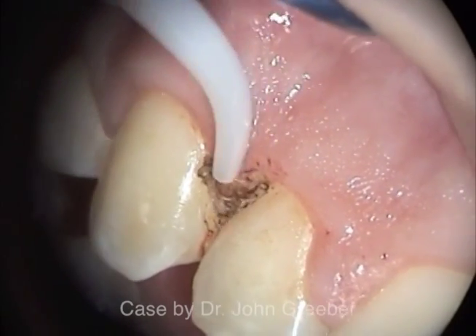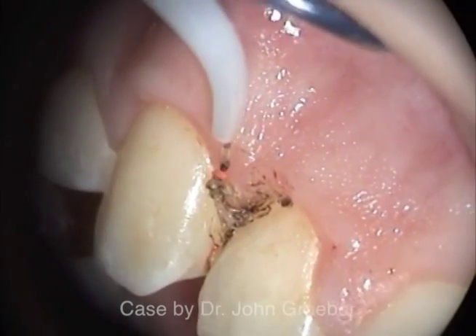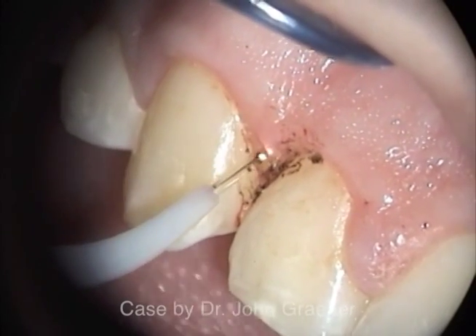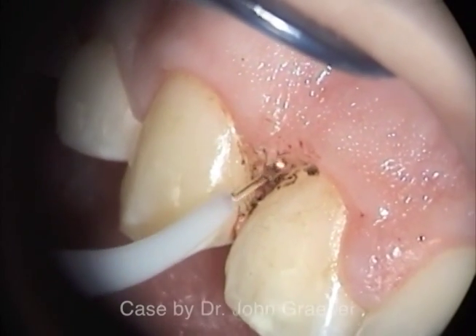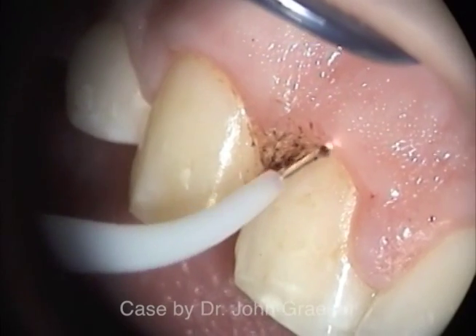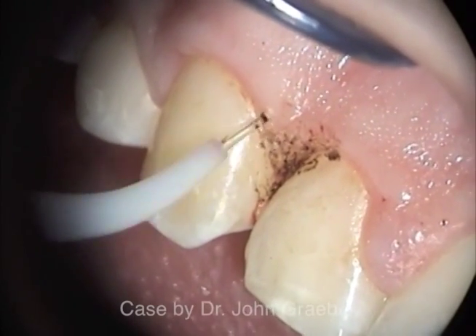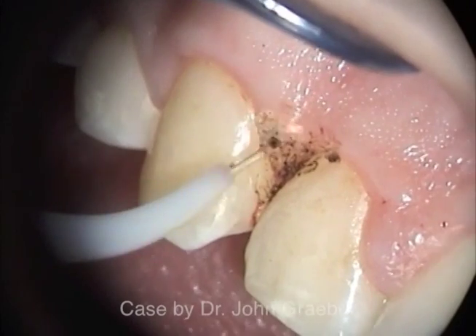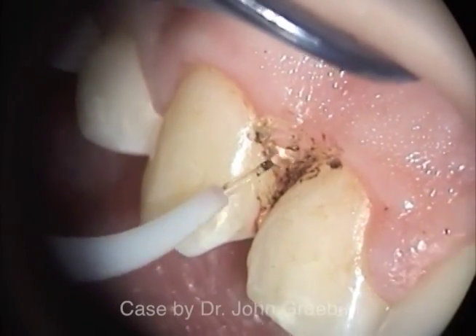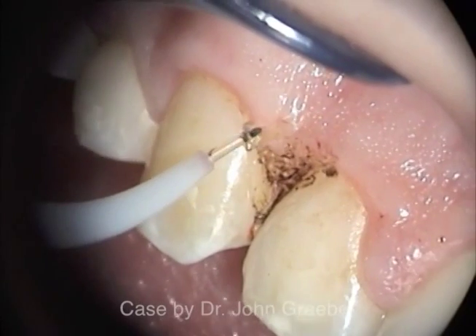Once the bulk of excess tissue is removed, the incision line is beveled into the adjacent attached gingiva. The time used for this part of the procedure should be minimized, as perpendicular lasing of pre-treated tissue will lead to unnecessary tissue charring.